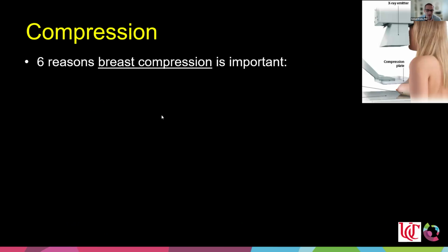So of all the other things I wanted to talk about is compression. Compression is probably one of the more difficult factors to normalize in mammography. Too little, too much really directly affects the overall image quality and the patient dose. So let's talk about the 6 reasons why breast compression is very important in X-ray based mammography.